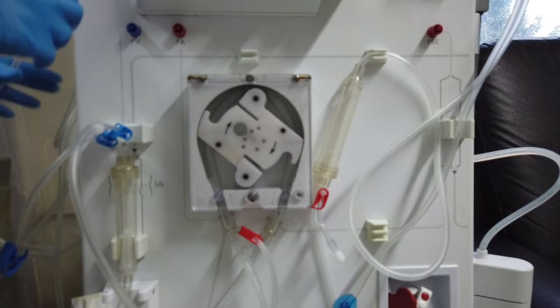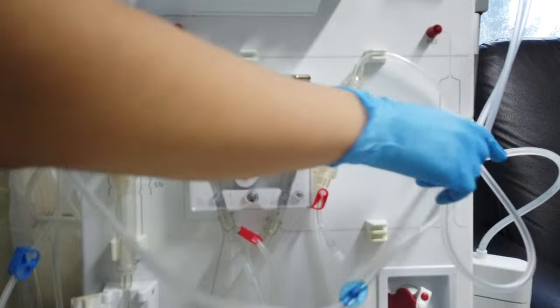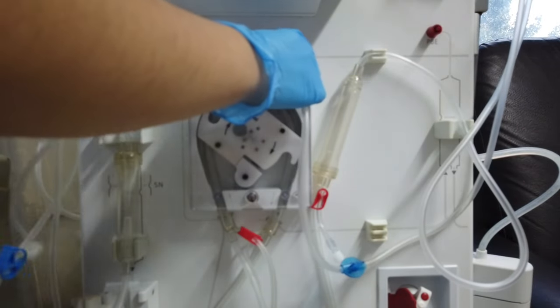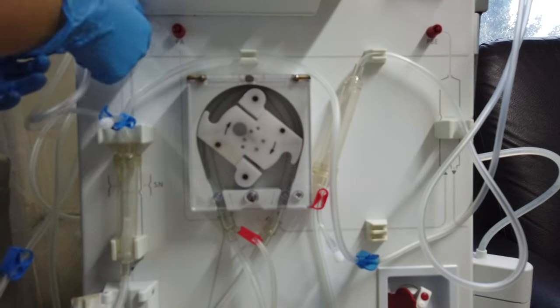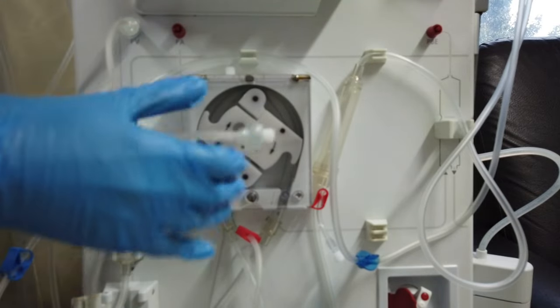Once everything is set up, it's time to do some arrangements. I tend to place the venous line onto the clip before connecting the arterial and venous pressure pods to their respective transducers.